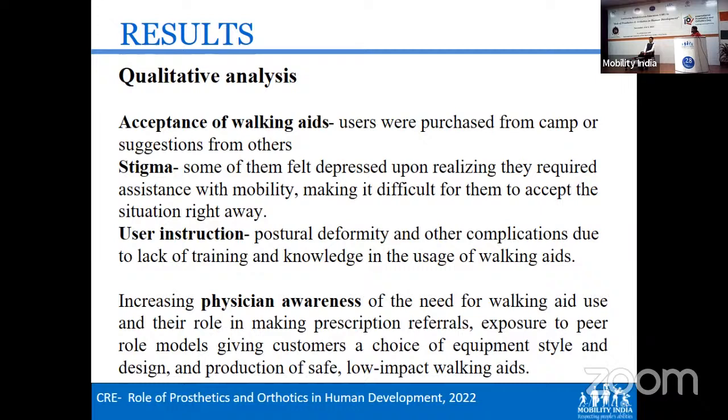Increasing physician awareness of the need for walking aid use and their role in making prescription referrals. Exposure to peer role models, giving customers a choice of equipment style and design, and producing safe, low impact walking aids. So here we have to educate them, and we have to give them a choice to select the equipment tools.